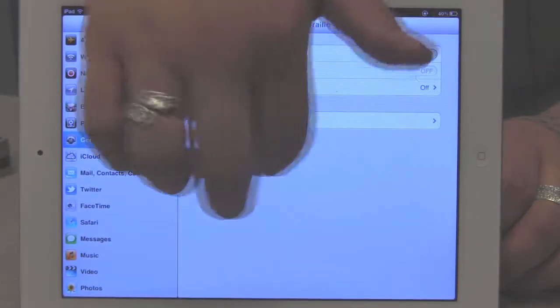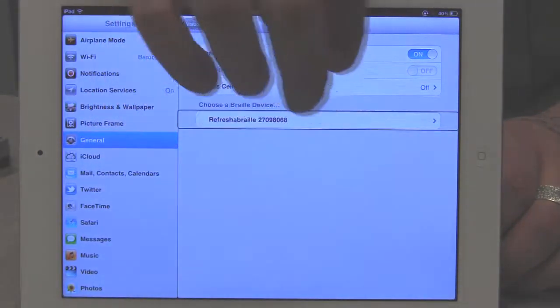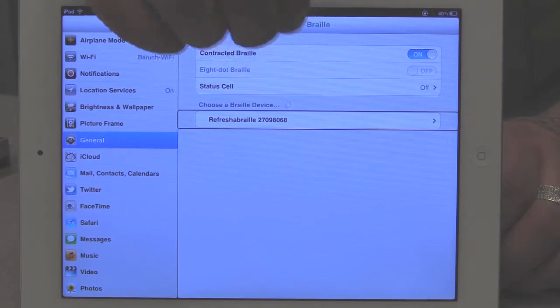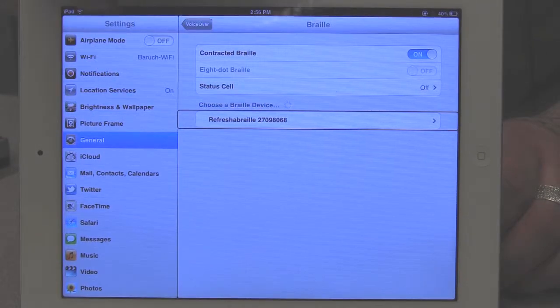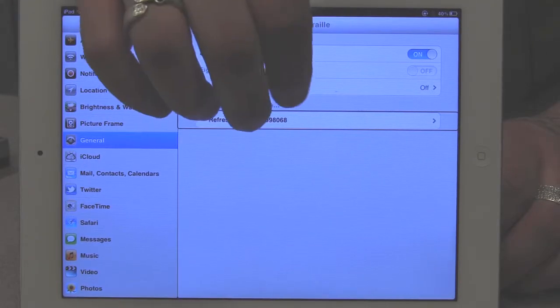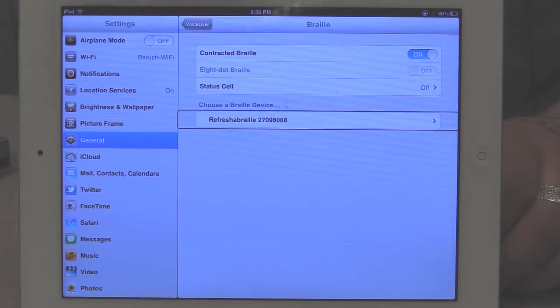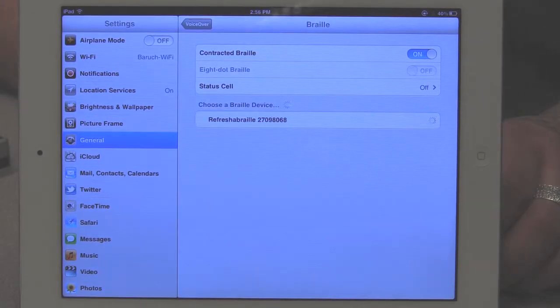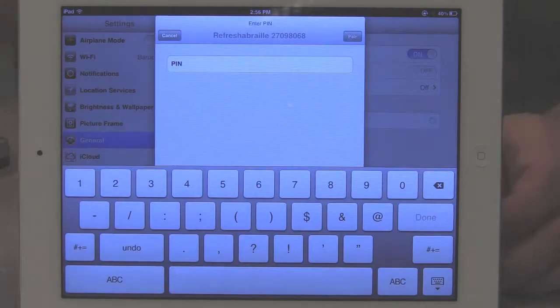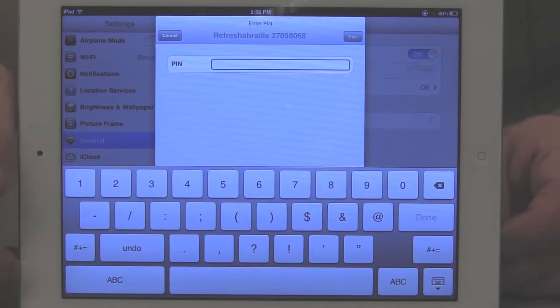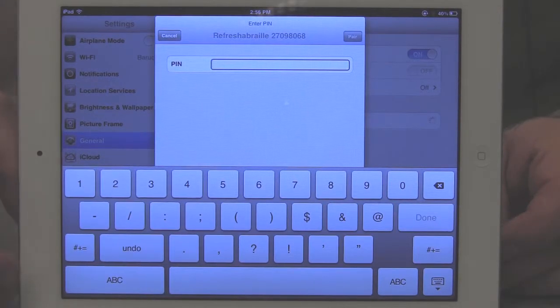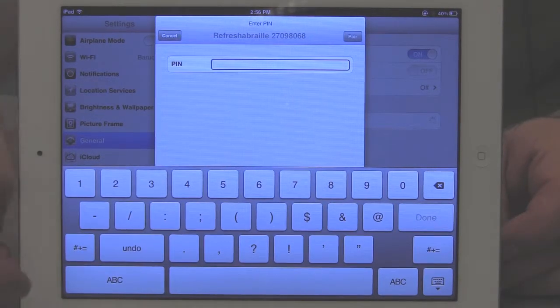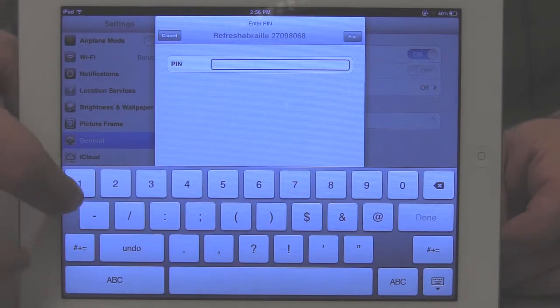Choose a Braille, in progress, Refreshable Braille. And I'm going to double tap that. Refreshable Braille, PIN, secure, text field, is editing.